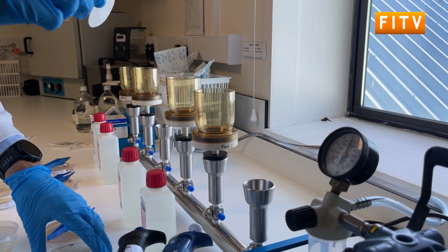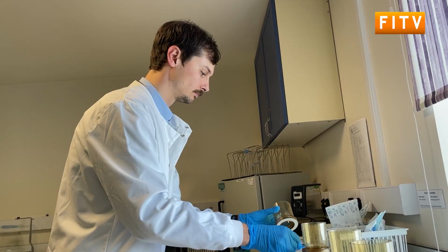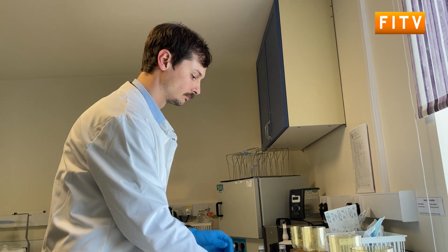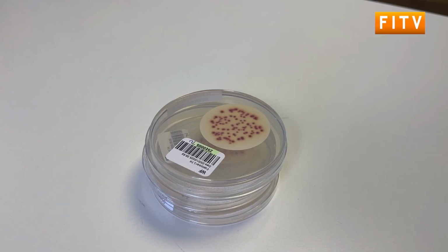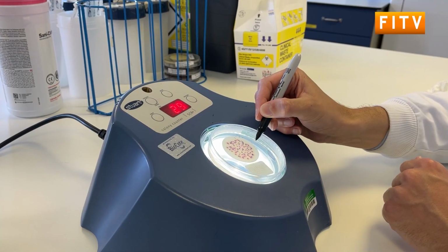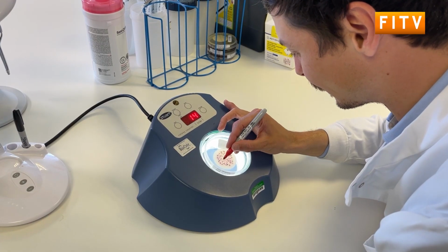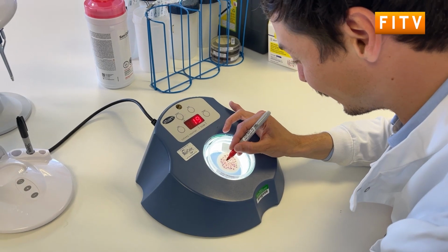So I'm in the food and water lab, so as the name suggests, I mainly receive food and water samples. The majority of my samples, in terms of food, come from the fishing vessels, so I'll get frozen blocks of squid and frozen fish, and that's tested as part of their export requirements. And then for the water side of things, we're testing the quality of the potable drinking water. But the primary reason for the accreditation is for that export to the UK and to Europe. So it just provides assurances to people buying the products that they've been handled correctly and are safe for consumption.